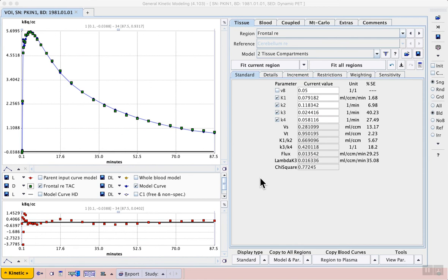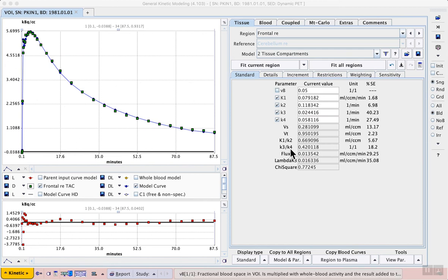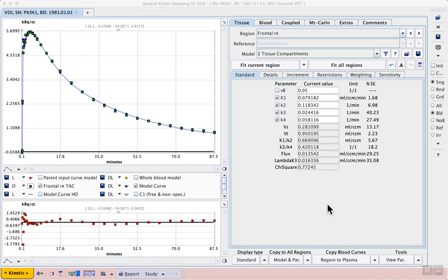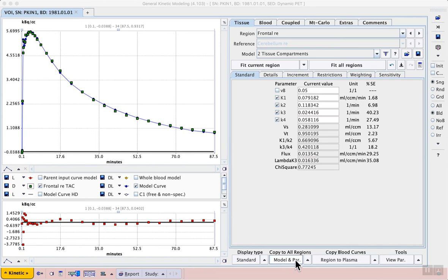Now that we have tested our model in one representative region we want to copy the model and the starting parameters to all of the other regions before fitting them as well.